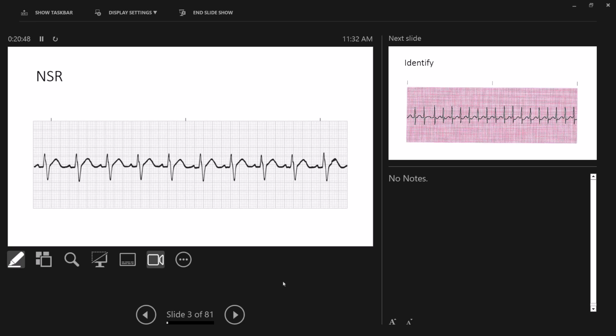Now, again, as you've seen, I've given you extra credit when you go into greater detail and tell me, particularly with PACs, PJCs, or PVCs, that it is the third and the sixth complex in there, or, particularly with PVCs, whether they are polymorphic or monomorphic. Is this couplets? Is this triplets? Is whatever else is going on in there? So again, remember that in that regard.